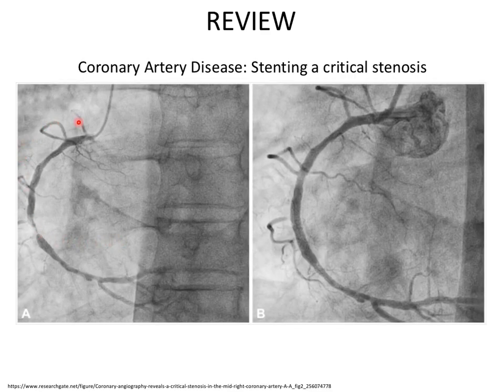Here's an example of somebody who presented probably with ST elevation. They have a critical stenosis on X-ray coronary angiography. If you're looking, they have a stenosis here and also one down here. This is irregular, and this is irregular up here. It's a messy vessel, right? There's a lot of disease in this vessel. But one would assume, looking at this picture, and this is how it's done, that this is probably the thing we should fix in order to restore blood flow.